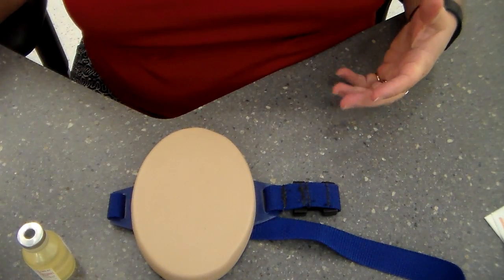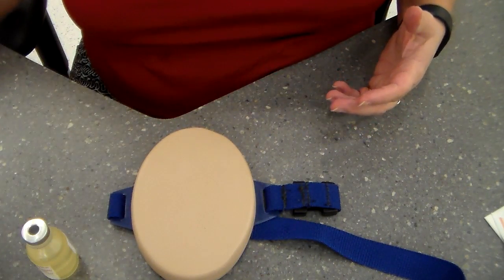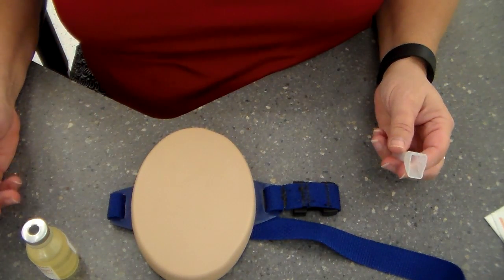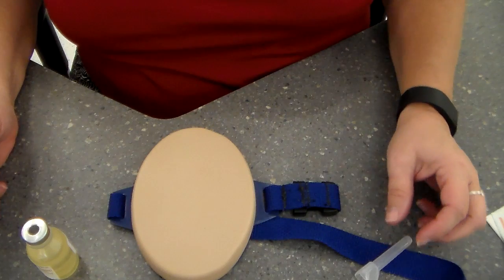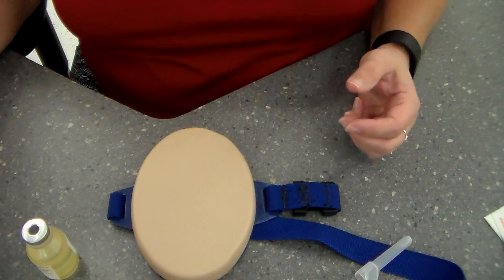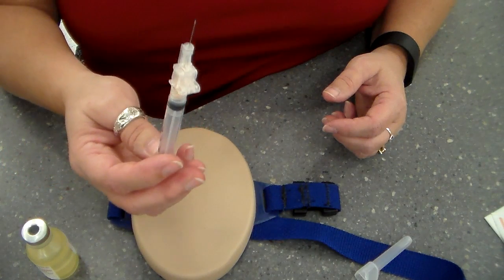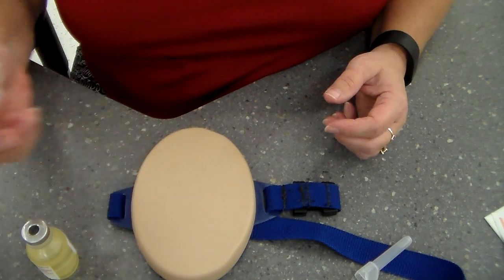You're going to draw up the correct amount of medication. You're going to make sure that you have the correct dosage, the correct route and all that. You're going to make sure you also have the correct needle for a subcutaneous injection.